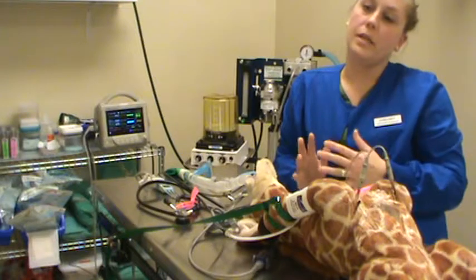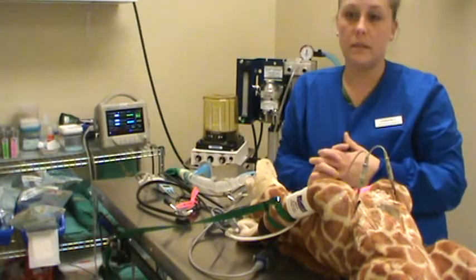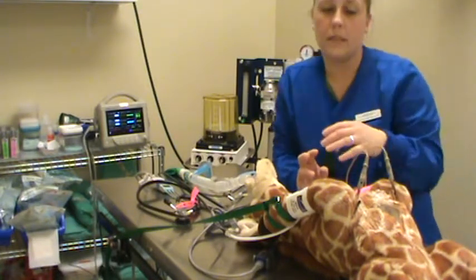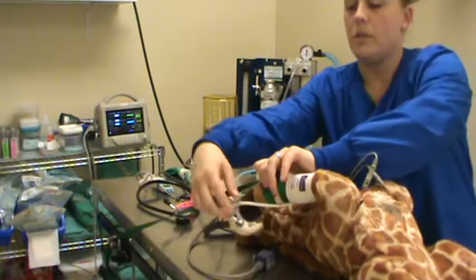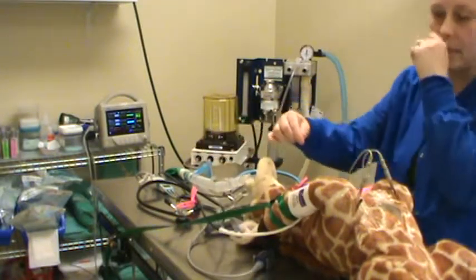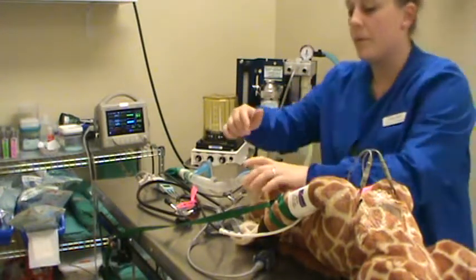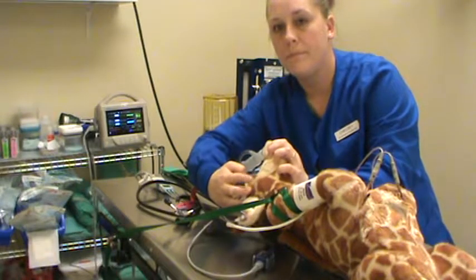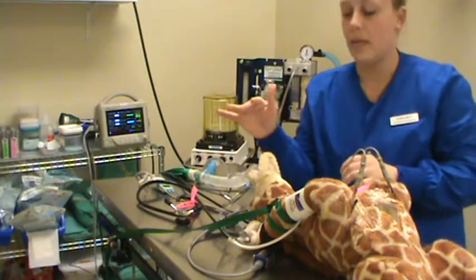So stage 3, plane 2 is going to have most of your reflexes absent. Muscles are going to be relaxed. So I'm going to go over the reflexes now. So we have a toe pinch here. So you can't see that. So you can pinch a toe, which is the pedal reflex, and if they pull back, then they're a little too light. We can go over the, can't really see it, but palpebral is going to be on the lateral canthus of the eye here, so you can just tap. That one's going to try to be absent as well if you're under a good level of anesthetic.